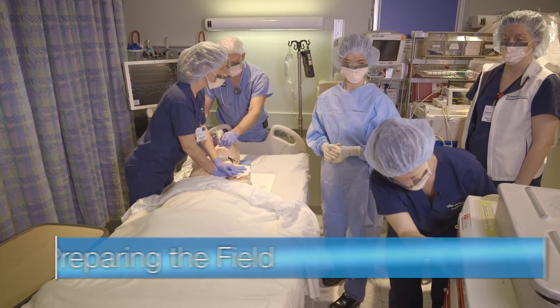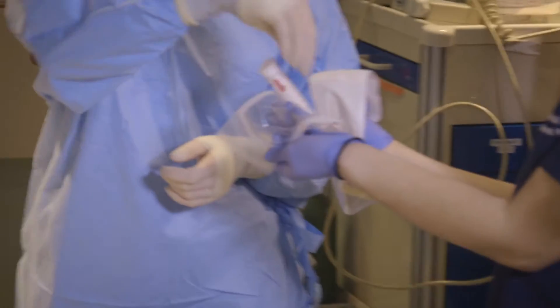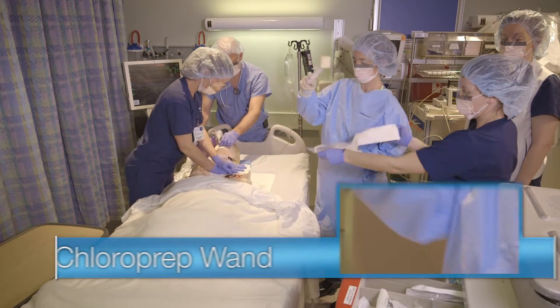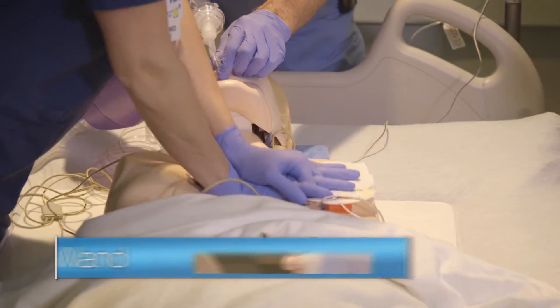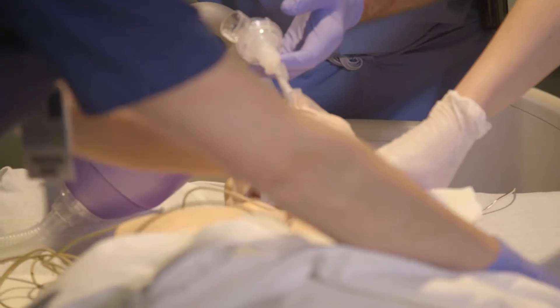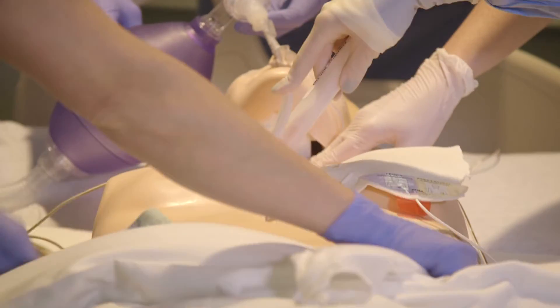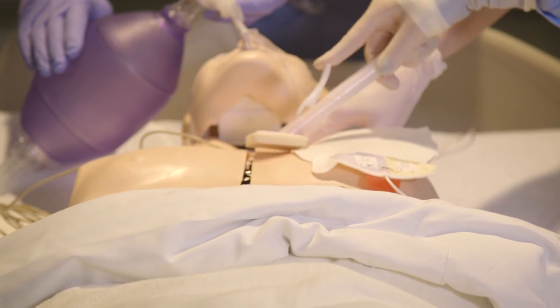Once the mid-levels have gowned and gloved, the tamponade nurse will assist in preparing the sterile field. The tamponade nurse will hand the mid-level a chloroprep wand. If performing chest compressions, the chloroprep will be applied at the two-minute mark while the rhythm is being checked.